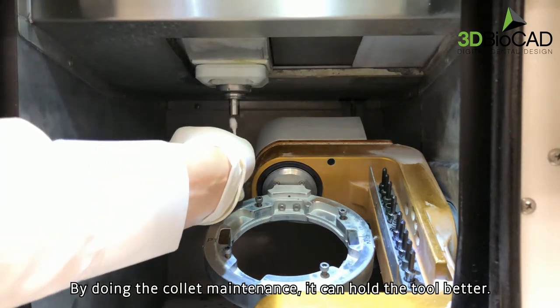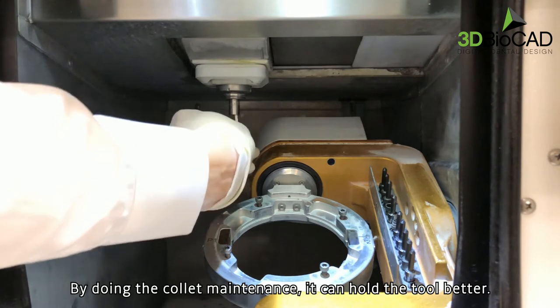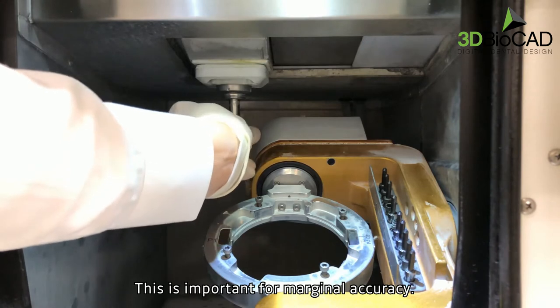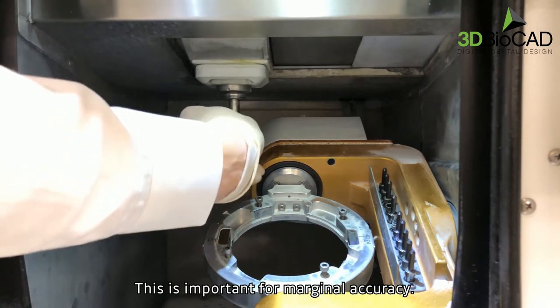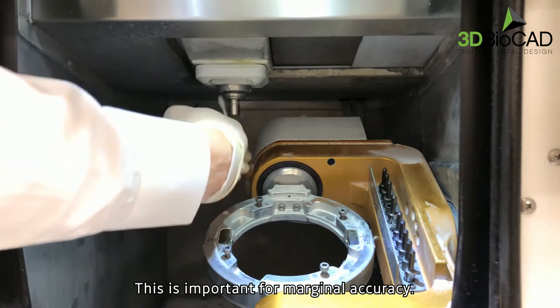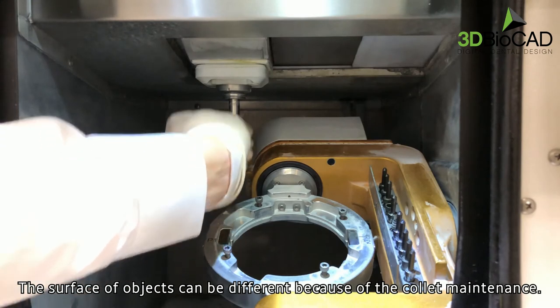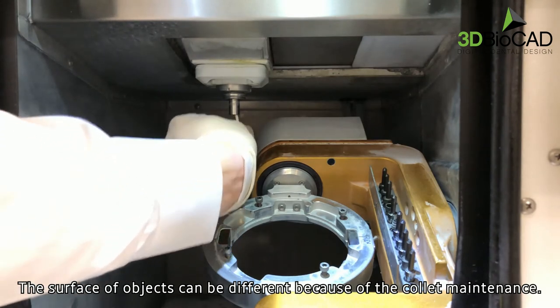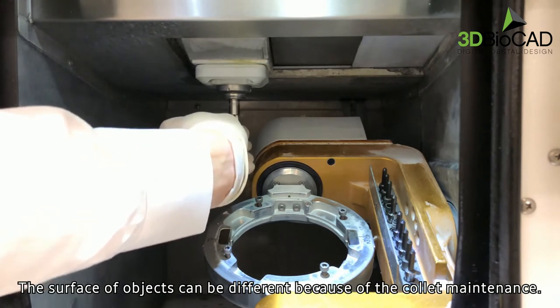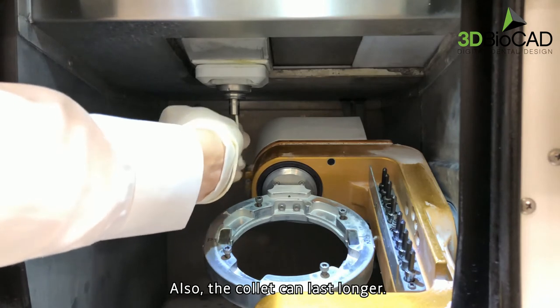By doing your collet maintenance, it can hold the tool better. This is important for marginal accuracy. The surface of objects can be different because of the collet maintenance. Also, the collet can last longer.